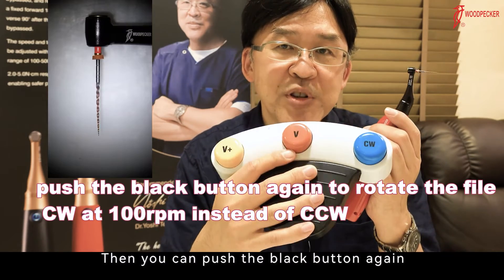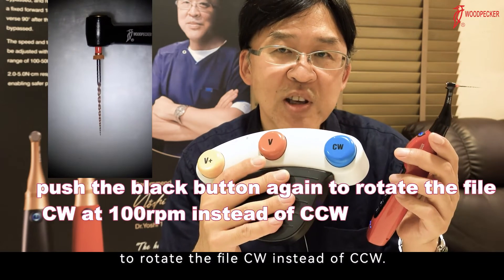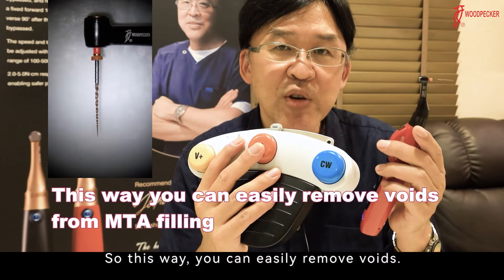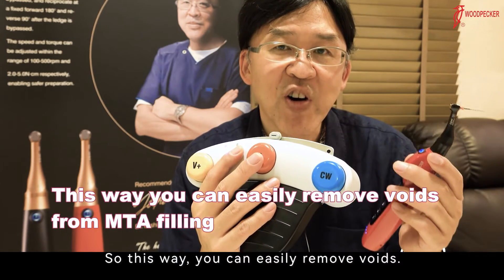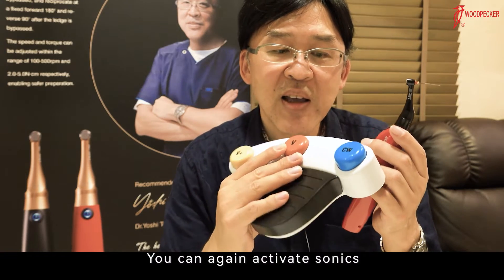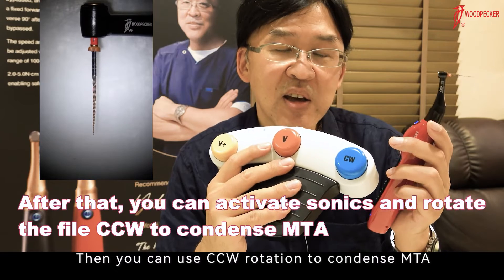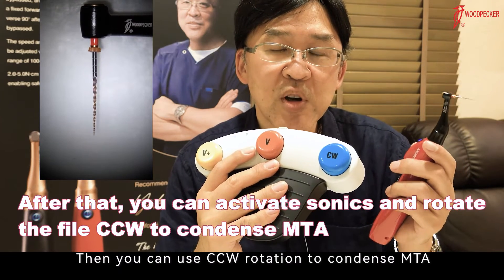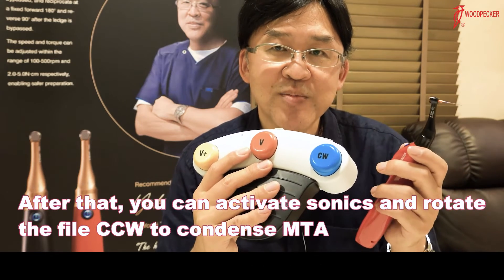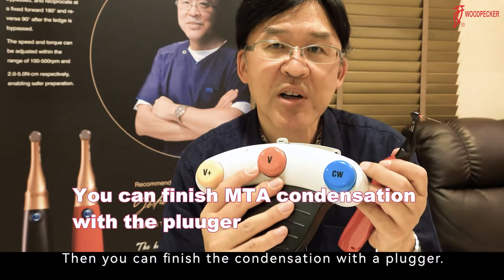You can push the black button again to rotate the file clockwise instead of counterclockwise. This way, you can easily remove voids and do it again. You can activate sonic again, then use counterclockwise rotation to condense MTA after you remove voids. Then, you can finish the condensation with a plugger.